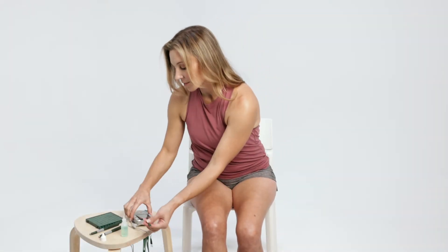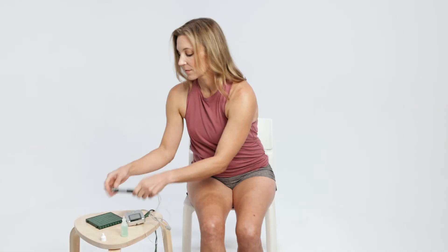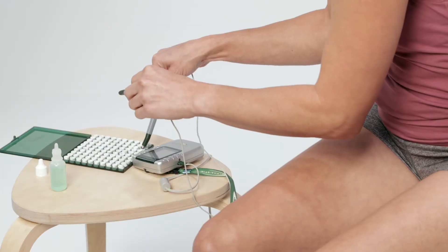Plug lead wires into the Alphastem M and pin plugs into the smart probes. Either channel one or two will work. Apply probe electrode pads to probes by placing the clean probe tip into the PEP in their green case.